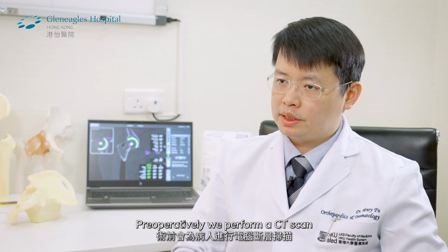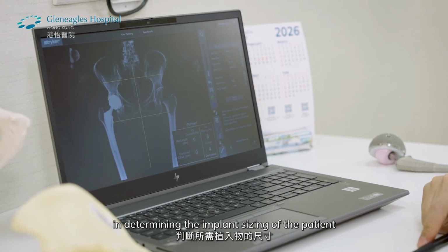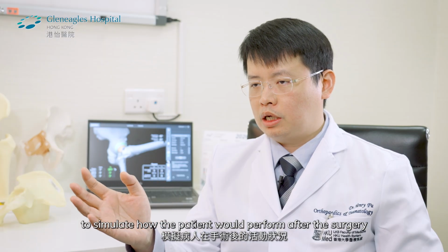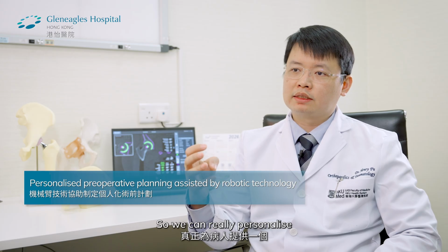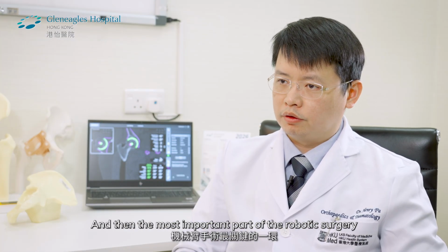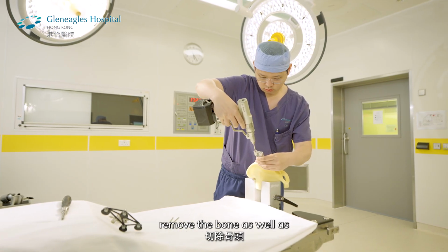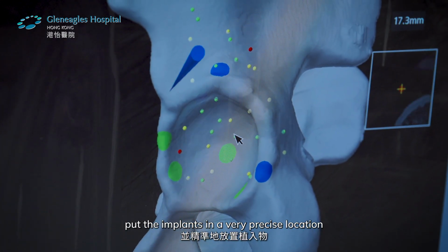Preoperatively, we perform a CT scan, which is very accurate in determining the implant sizing of the patient. We can have a very precise planning and what we call a virtual range of motion to simulate how the patient would perform after the surgery. So we can really personalize the whole surgery for our patients. And then the most important part of the robotic surgery is the robotic arm would help us remove the bone as well as put the implants in a very precise location.